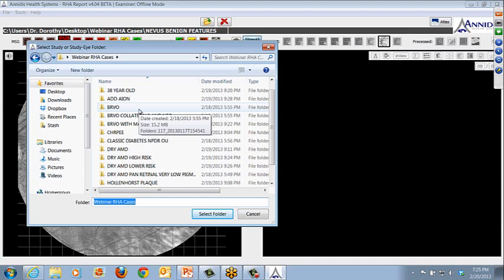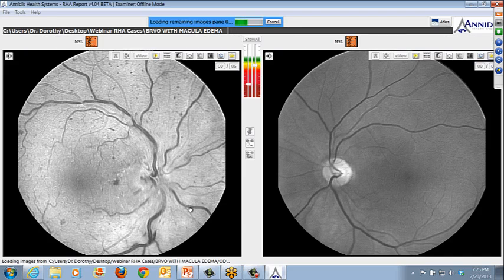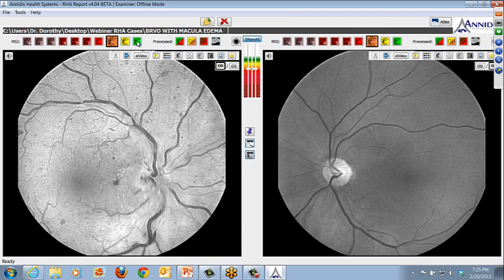And I think there were a lot of questions about changes in the vasculature that I had annotated in the patients of interest interpretation. So I don't have one right here, but let me pull up this BRVO and let's talk. I can use this as a generalized example to jog my memory about some of the vascular features that you want to look for.